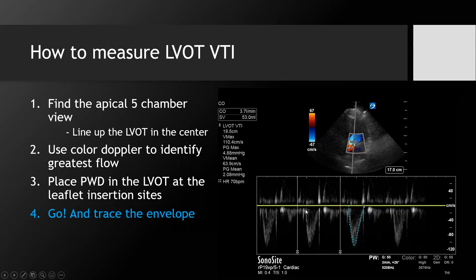Now you'll notice, so this is your speeds, right? So this is the range of speeds, and you'll notice that the envelope is kind of narrow, kind of dark in the middle, because you're getting just one spot. And so blood is traveling through that spot pretty uniformly. It speeds up and it slows down, right? There is nothing at this point in time traveling at this speed, right? Whereas if you were on continuous wave Doppler, you would be getting speeds of anything here. So you generally would have a filled-in envelope representing all the speeds along the length of this line. But because we're on pulse wave Doppler and we're only getting the speeds of blood as it's moving through here, we get this cleared-out envelope where the outline is white. Those are the speeds that we're seeing, whereas the inside is generally not filled in.